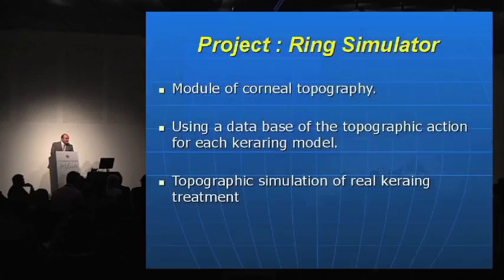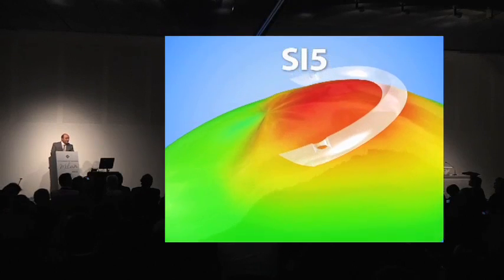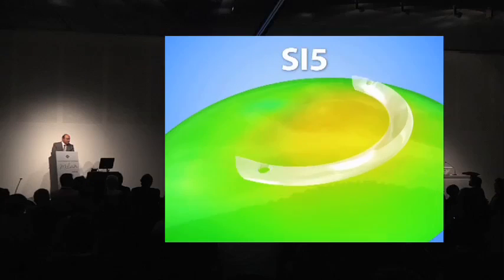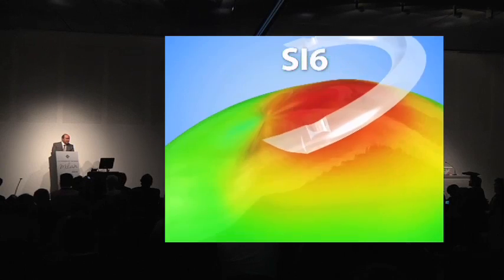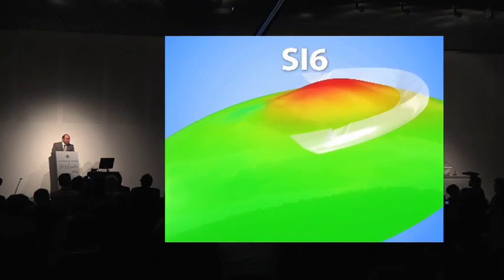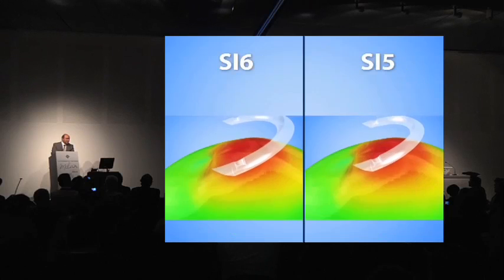I would like to speak briefly about a new project: a ring simulator. It is a software of corneal topography using a database of topographic actions of each Keraring model, which will simulate a real keratoconus treatment. This is the basis of the ring simulator, which simulates the action in a keratoconus case for both SI5 and SI6, so we can compare the action of both rings and make a better choice.